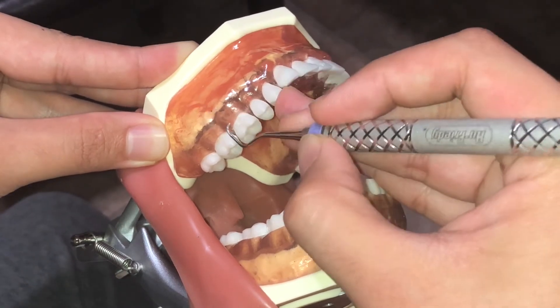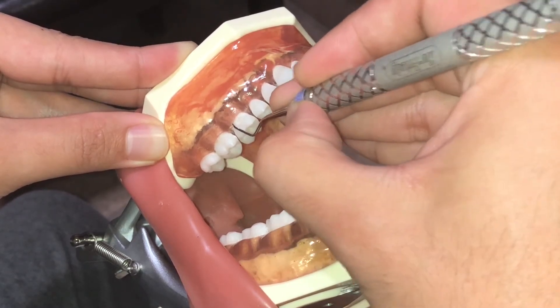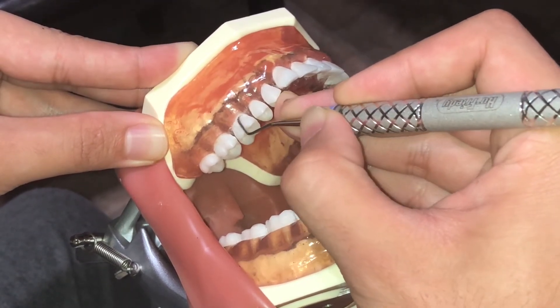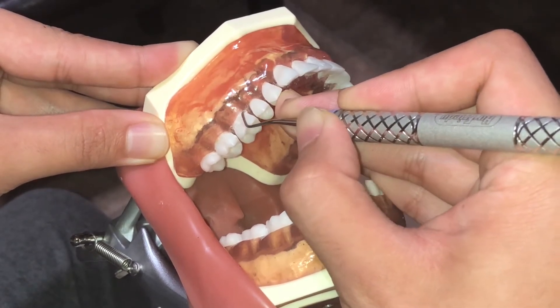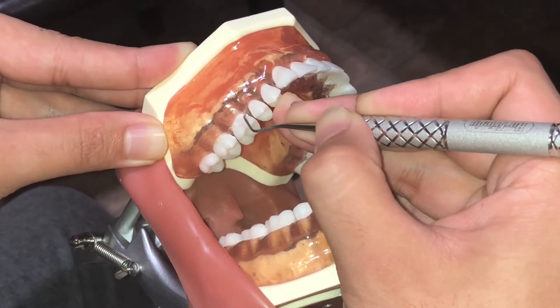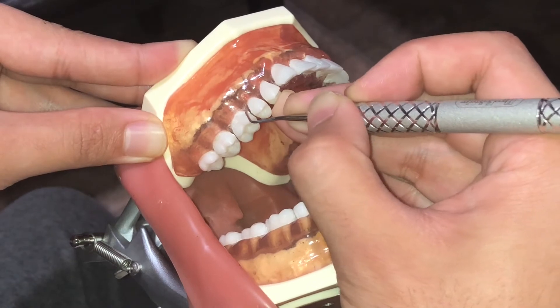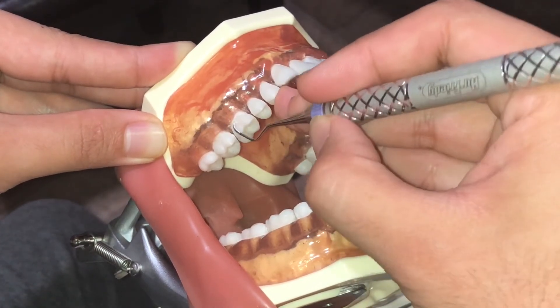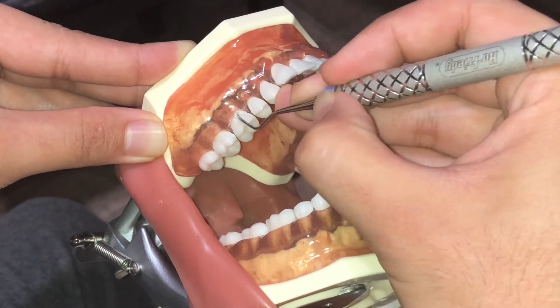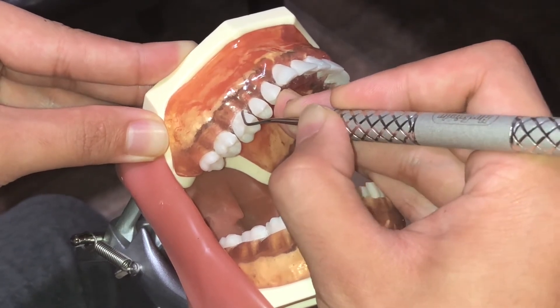Going to the buccal surface, I'll insert, angulate, and then activate. On the line angle, I'll adapt my blade, then insert, angulate, and activate. And adapt again on the line angle.